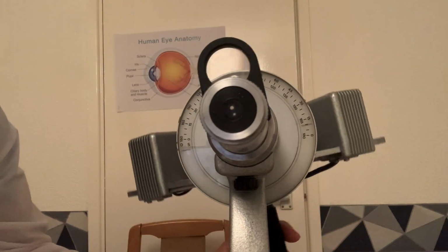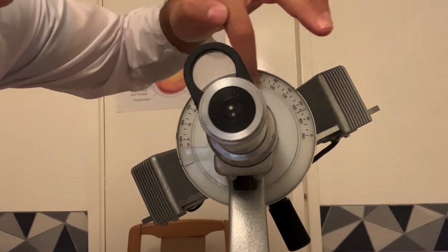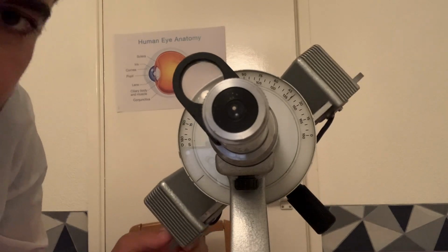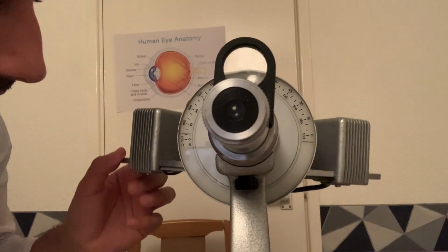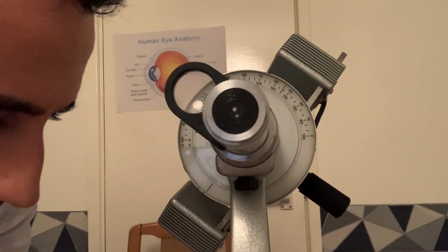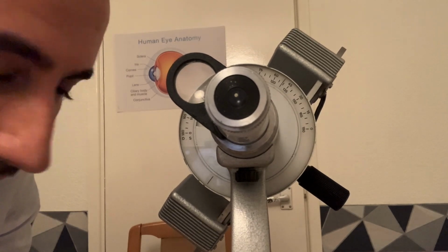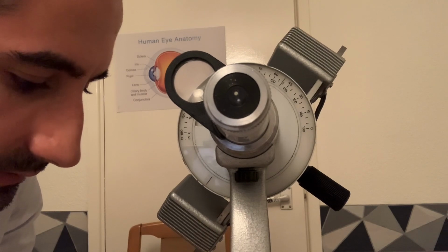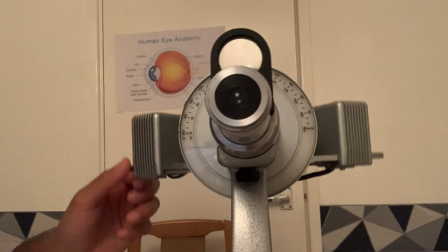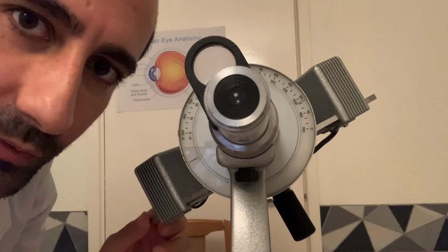We also have the axis scale on the outside here and an inner scale. So when we check the curvature of the cornea, we can check the axes too. So that's the keratometer. We also have, similar to the slit lamp, a wheel for adjusting the height and a joystick for bringing the machine closer to your eyeball or to take it further back. Okay, so maybe we should take some corneal measurements from your eyes.